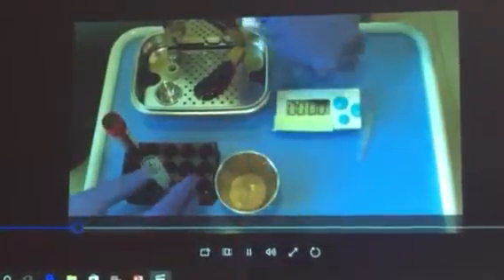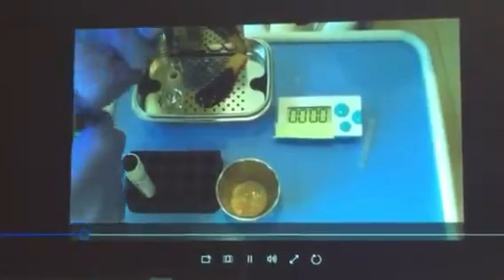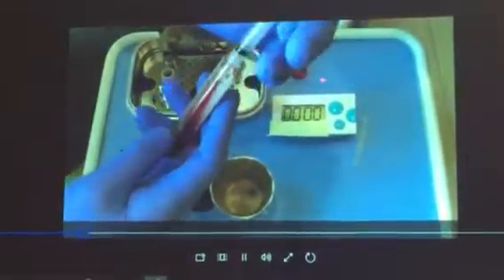This is a quick way of doing it. You can let it set like that, but it'll take about 15 minutes for it to become sticky. If you want to make it set quicker, you add a couple drops of blood from the red tube.